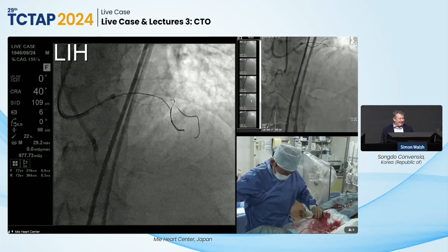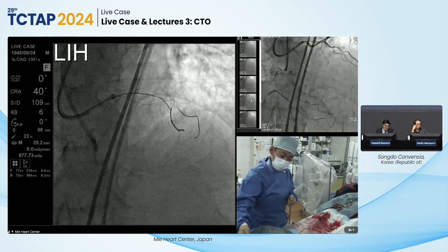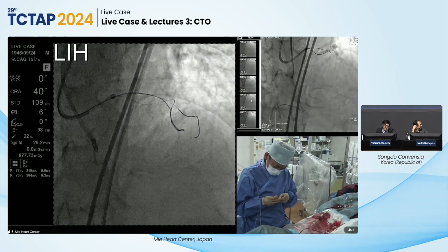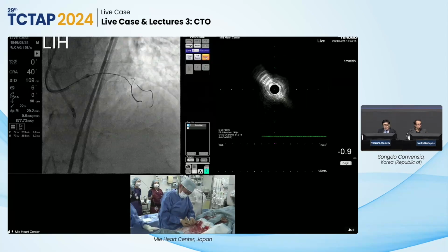Yeah, I mean, once we have not that clear visuality on the landing zone, I think what we're probably not doing is a lot of parallel wire technique there, because that might really destroy the landing zone and visuality is going down, and then you might end up in a hematoma or something like that.